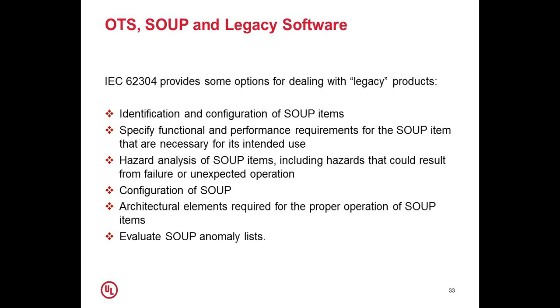Identification and configuration of SOUP items is very necessary. Specifying the functional and performance requirements of SOUP items that are necessary for its intended use of the medical device. Hazard analysis of SOUP items, including hazards that could result from a failure or unexpected operation. So this doesn't limit yourself to the development of the software within the manufacturer premises, but also the software which you have purchased for your use.